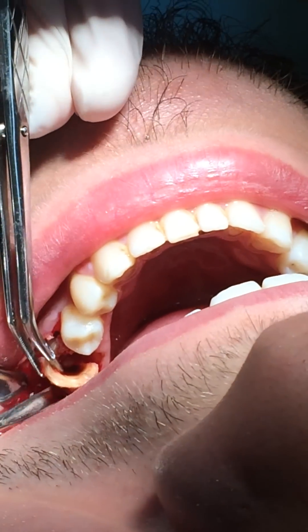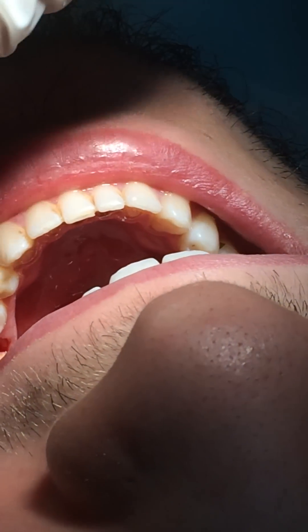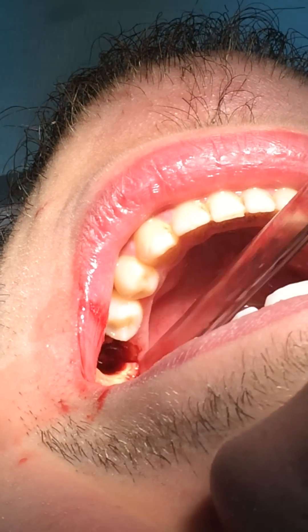So this is the easiest way to avoid any fracture of the alveolus. Can I have the forceps? Forceps. Yeah, this one, this one.